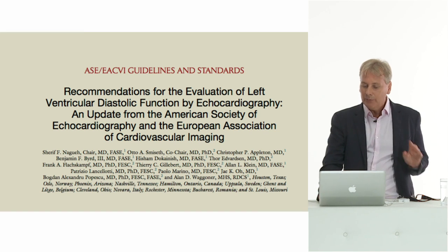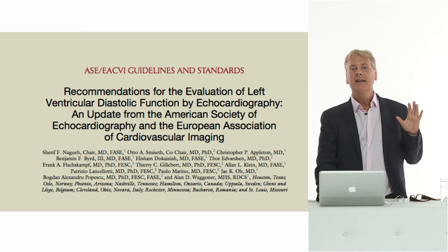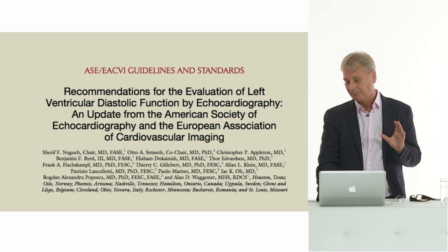Of course, we're here to answer your questions. You have the possibility of actually asking questions. We'll try to come back to these questions, and you also have the guidelines in your little window on the side for download. So there's a handout section where you can download the guidelines. What we will try to do is go through, I would say, the 9 most important steps or features of these guidelines, right? Yeah. I would say it's the 9 steps to heaven. Okay, the 9 steps to heaven.